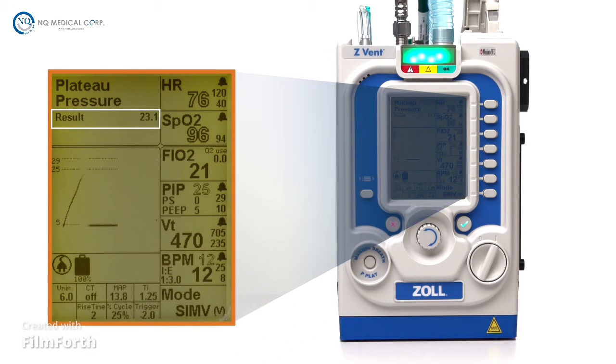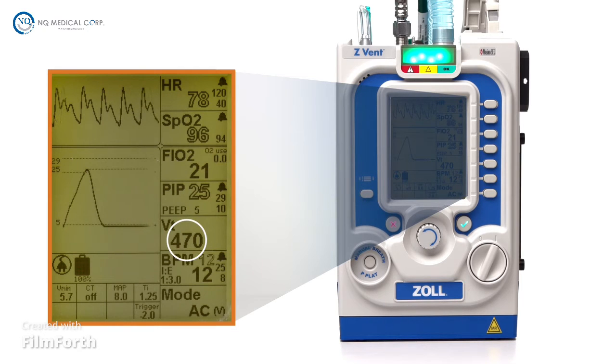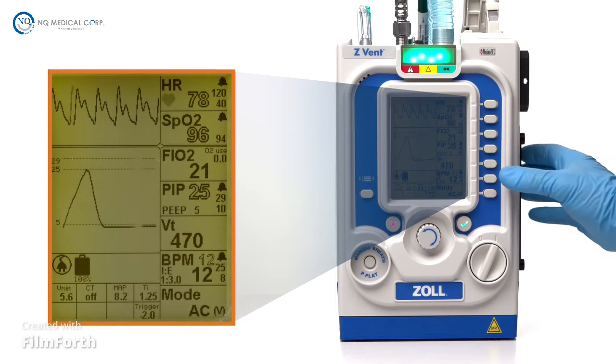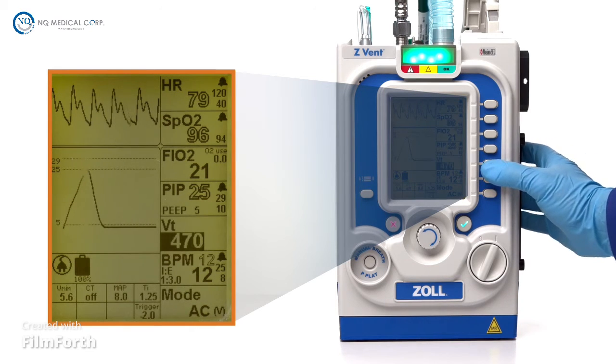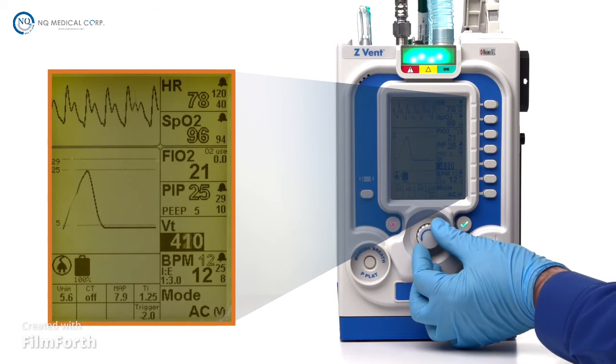The fifth window is tidal volume. When operating in volume-targeted breathing mode, the tidal volume is a solid numerical value and can be changed. The tidal volume can be adjusted from 50 to 2,000 milliliters. Press the parameter button once to change the desired tidal volume.